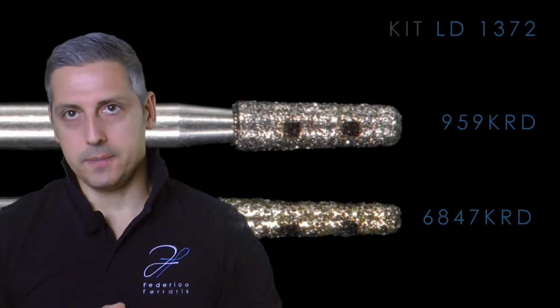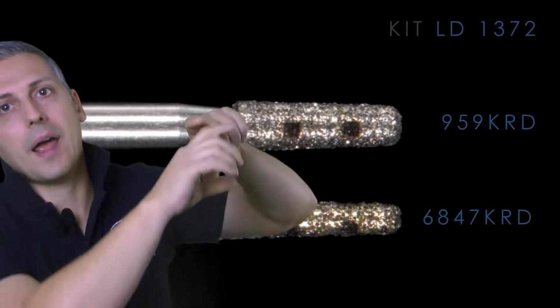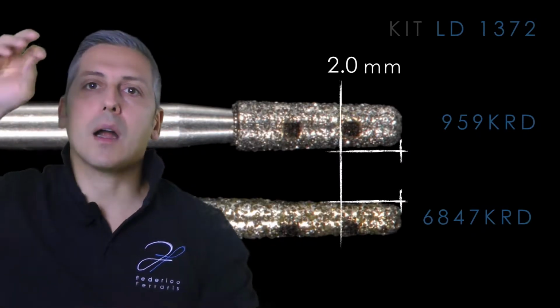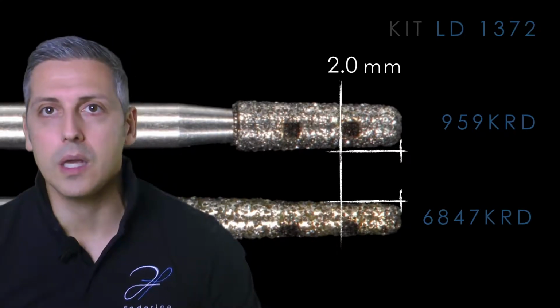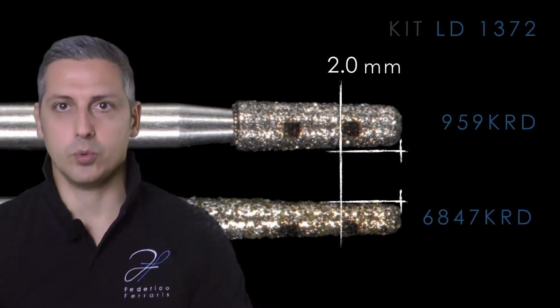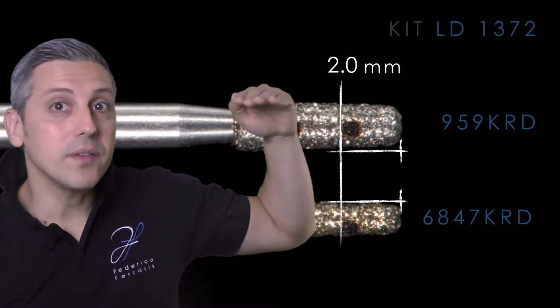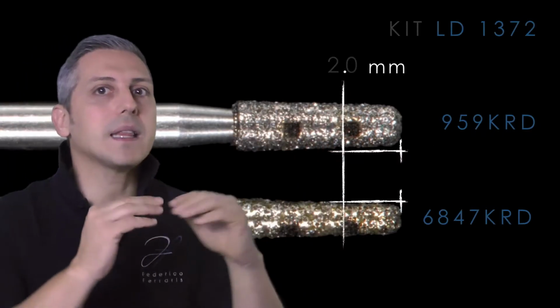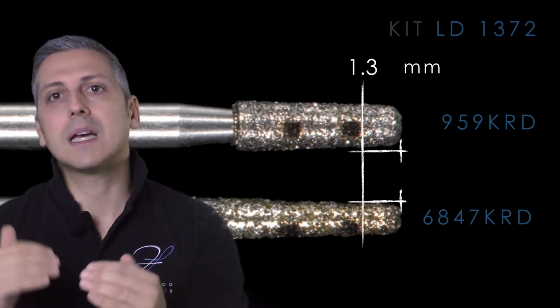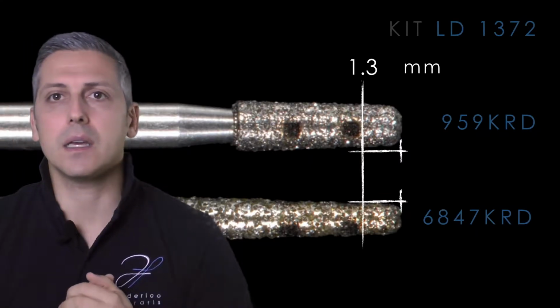The depth mark, how much is it? 2 millimeters. It means that if you go completely into the substrate that you want to prepare and you see the line disappearing in the substrate, you are creating a 2 millimeter depth. And that is the thickness we are looking for when we think of a bilayered composite restoration, if we are preparing on a sound tooth. In this case, if you decide to have 1 millimeter depth, you can use the first depth mark, achieving the cutting level by creating the groove at the first margin of the depth mark. In that case, you can achieve around 1 millimeter, a little bit more or less, about 1.3. And this is very interesting.